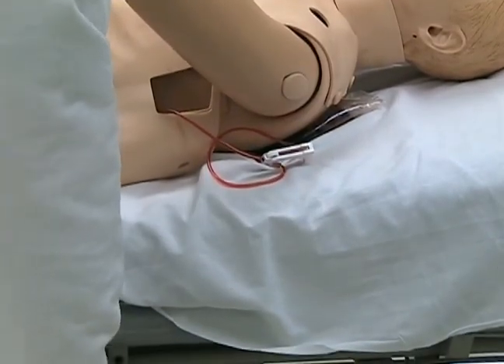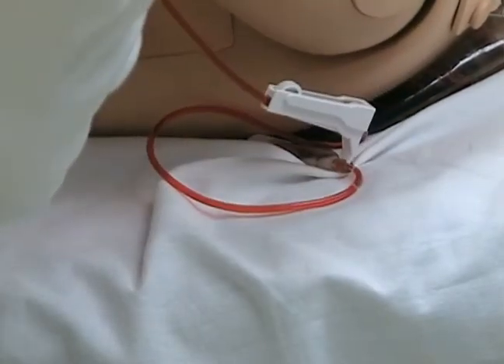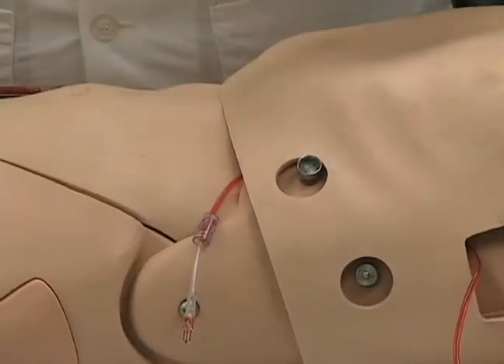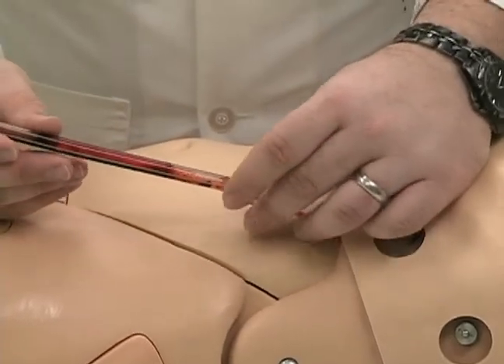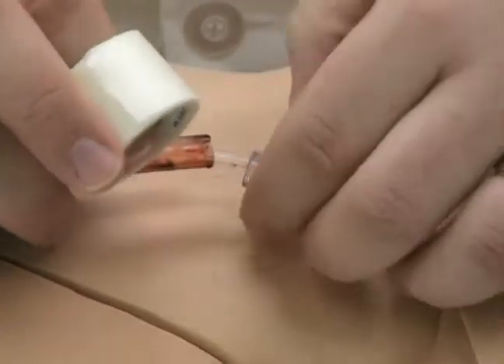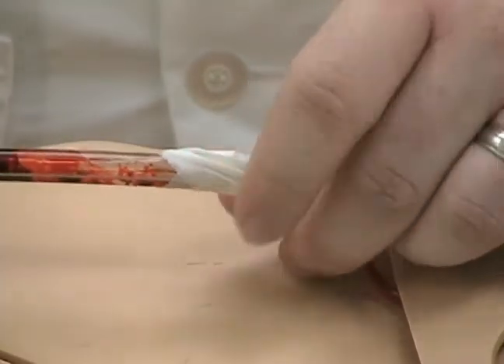By having the roller clamp in this position, a confederate in the midst of the simulation can open the blood tubing once the clot has been manipulated. Once the tubing has been fed underneath the end of the chest skin, we insert it into the end of the chest tube above where the clot is. We secure this with a couple of rolls of tape. This prevents leakage into the inside of the mannequin during the simulation.